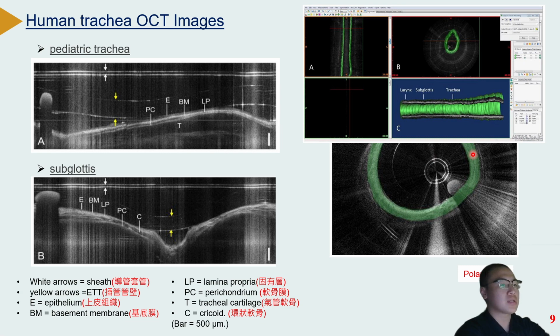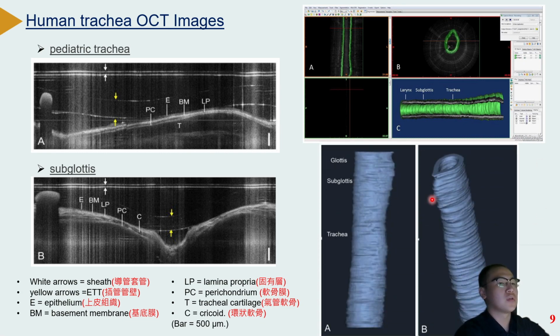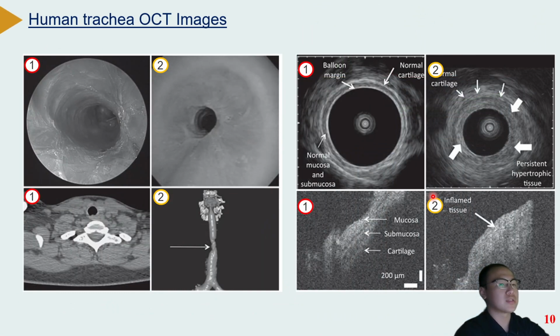And when they have the 3D model, doctors can make cross comparisons between the CT bronchoscopy image and the OCT image. In the future, we hope that the OCT image alone can be used for rapid and accurate diagnosis.